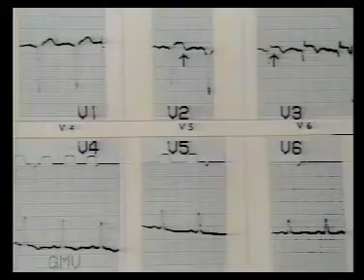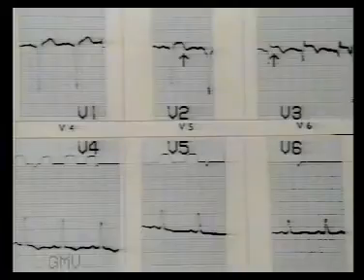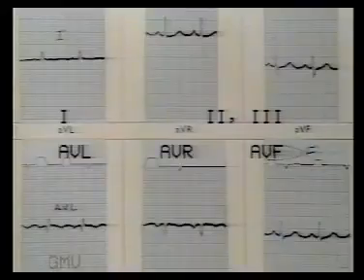In this ECG, the chest leads show ST elevation in V2 and V3 only. This indicates a small anteroseptal infarct. It is about 2 to 3 days old as T wave has started inverting. The limb leads may not show any changes in a small anteroseptal infarct. Here, there is minimal ST elevation only in AVL.